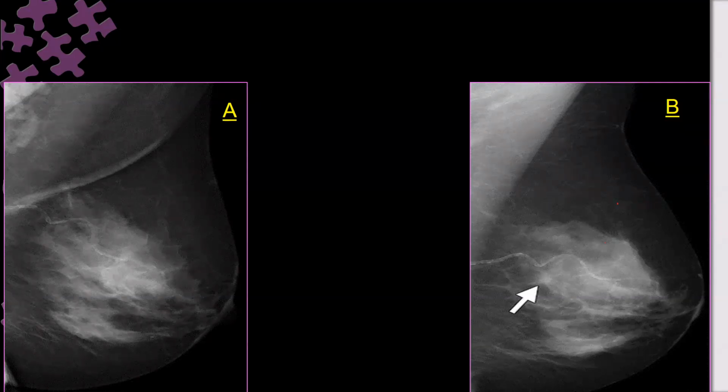There is tissue overlap in image A, and the mass is not obvious in A. After compression in B, the mass is obvious now. Excellent, well done. This is the exact explanation. How can I make sure? How can I defend myself more? Why do I suspect the second has better compression than the first?